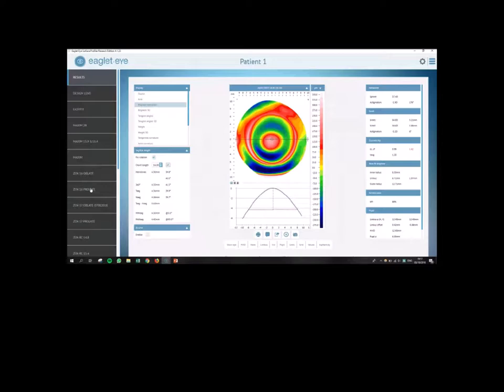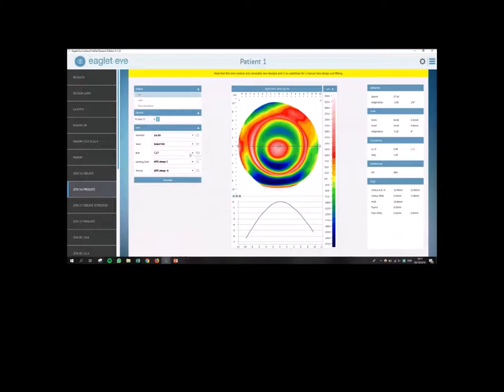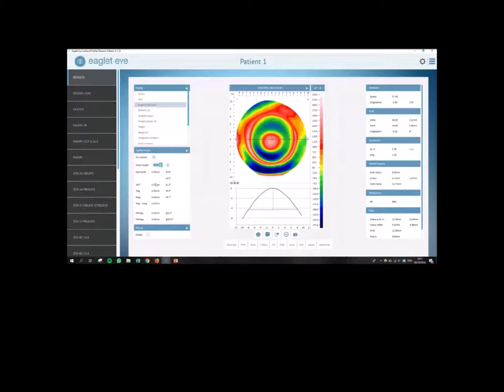The other thing we can check is the average sagittal height, which is 4700. If I go back to the result page, and I type in that 16 again, the next thing I want to look at is the average sagittal height up here. The average sagittal height at 360 degrees. So we can see that's 4.35.